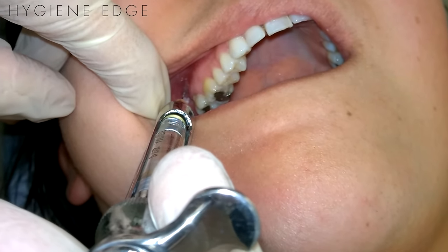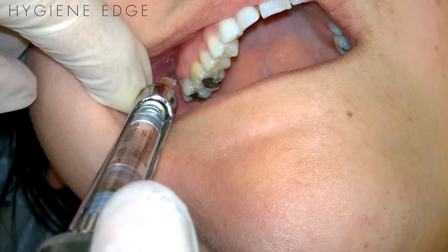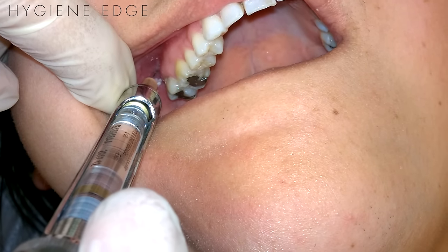I like to think of this injection as a PSA with a long needle, since the main difference between the two is that you use a long needle to be able to reach the maxillary nerve as it runs through the pterygopalatine fossa.